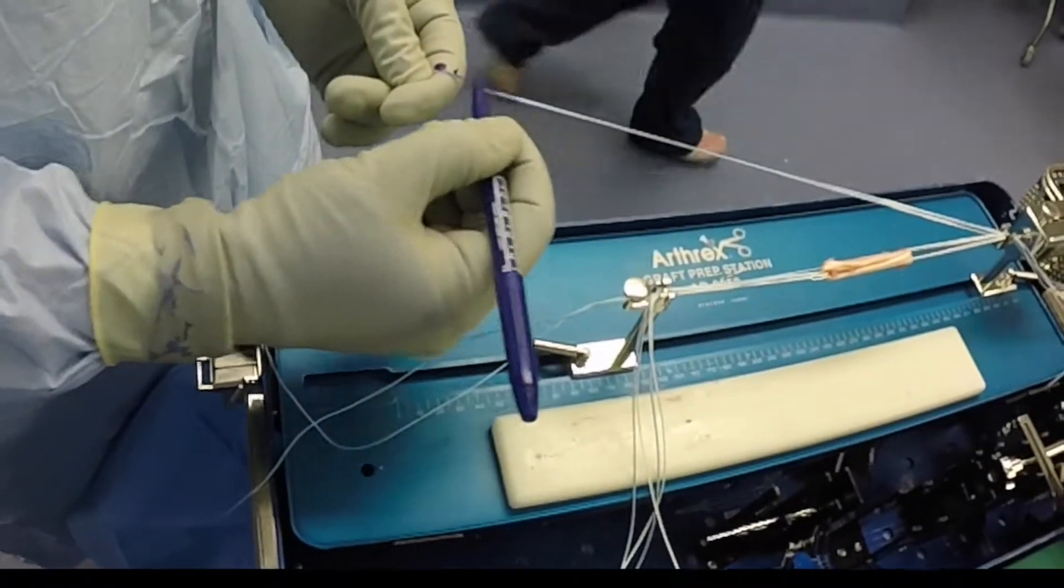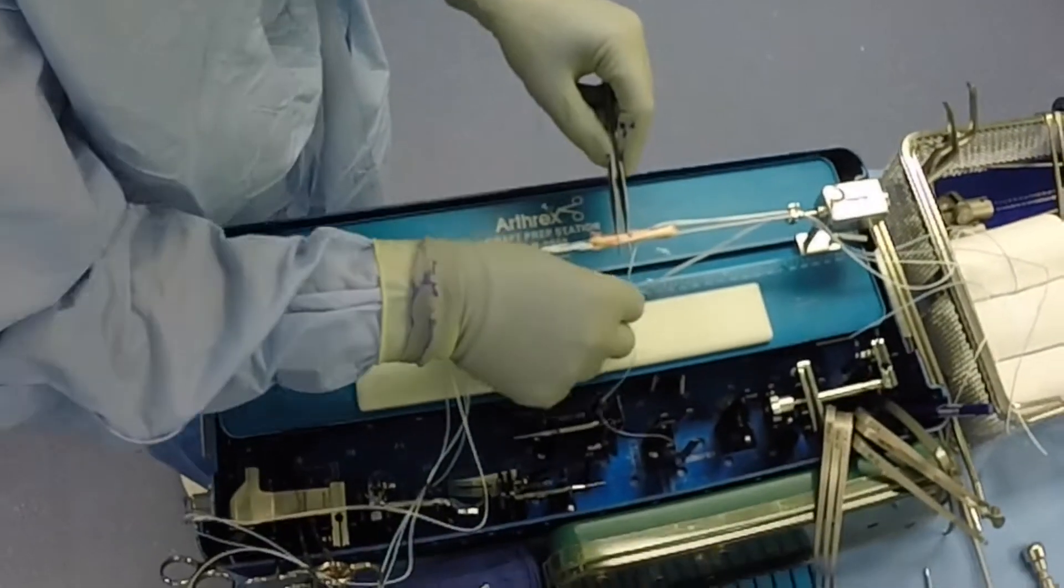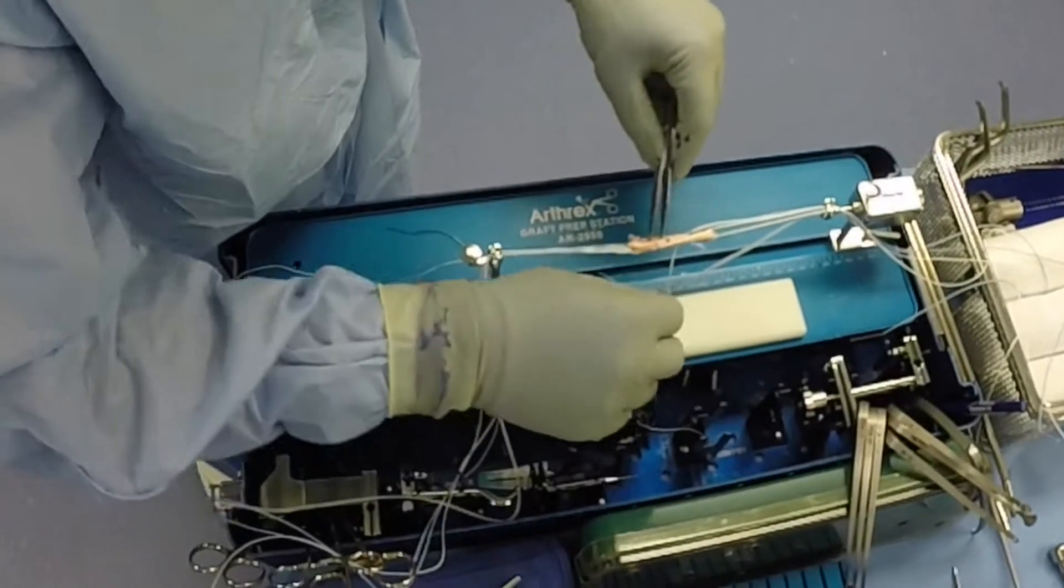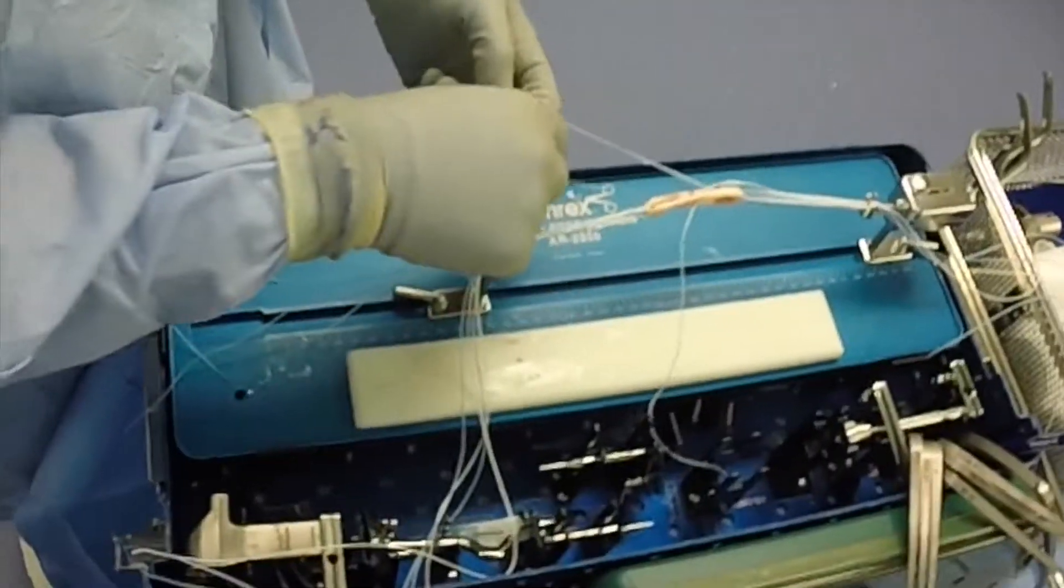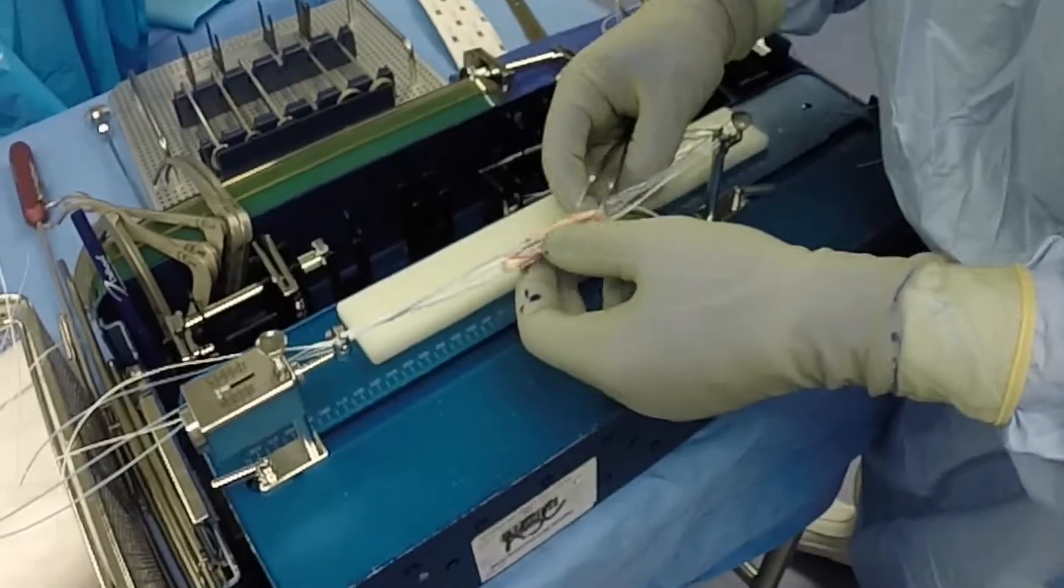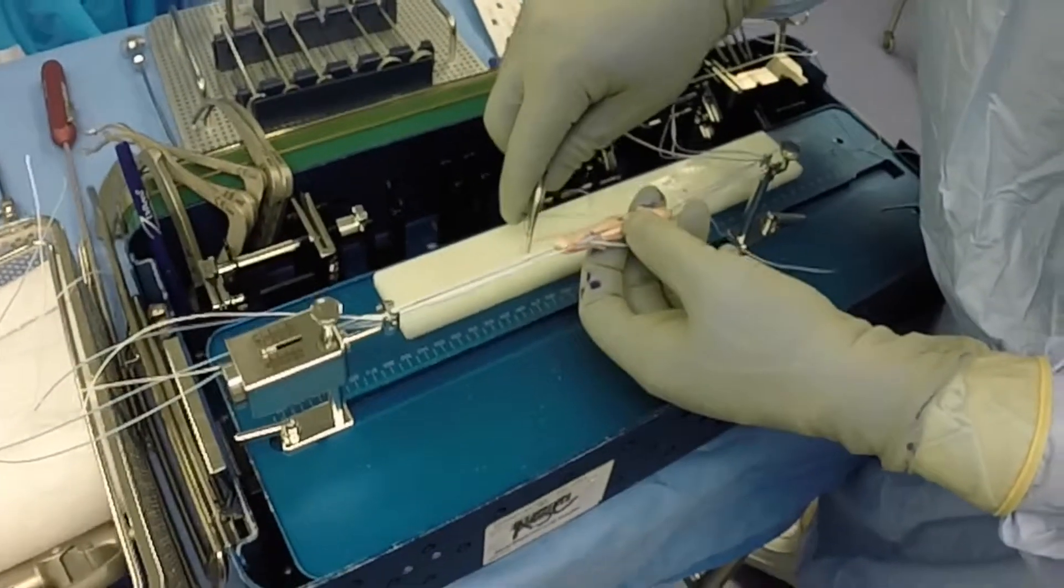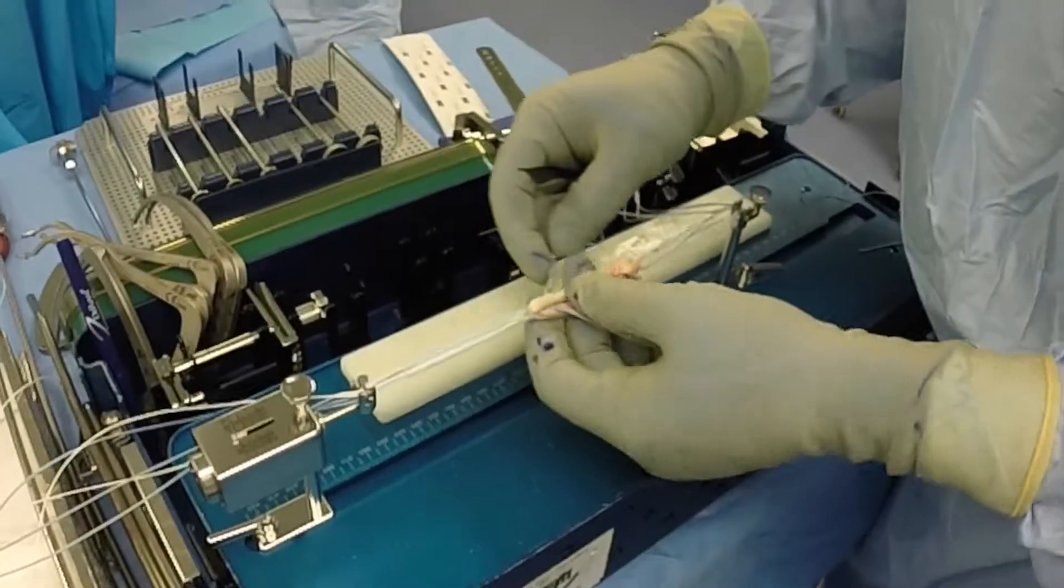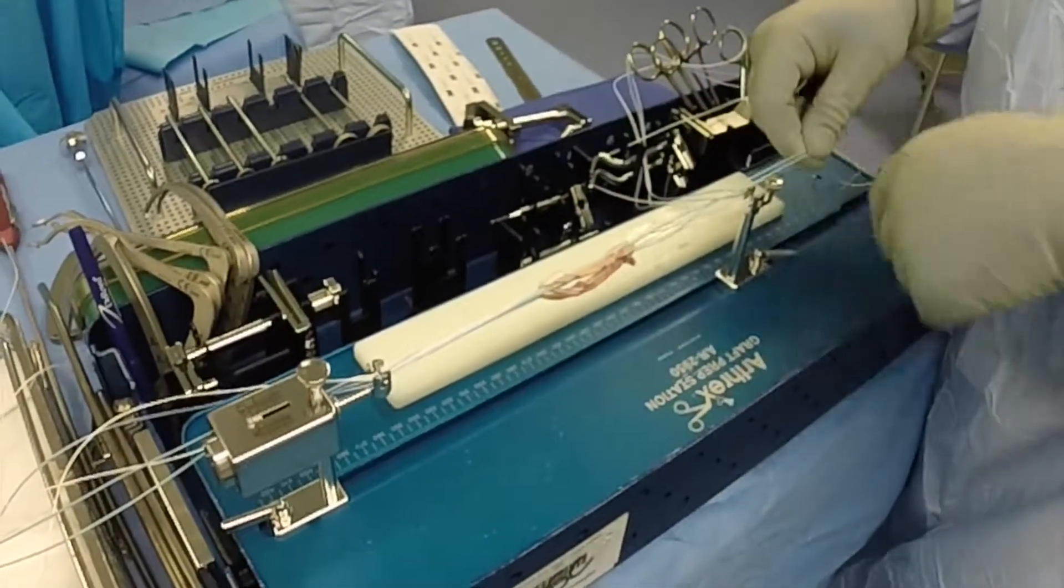The FiberTape sutures are then marked for easy identification upon suture passage and passed in a crosswise fashion centrally within the graft such that they will be buried within the graft in the intra-articular portion.